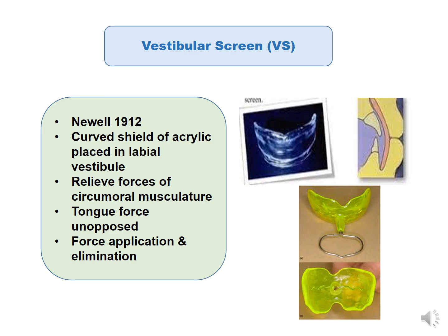Therefore the action of the vestibular screen is both force application, whereby the force of the tongue is utilized, and also force elimination, whereby the effect of the lips is restricted by the vestibular shield.